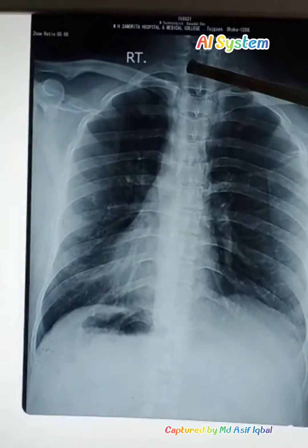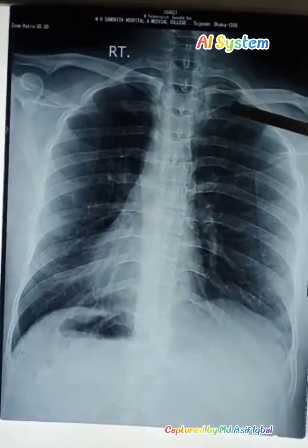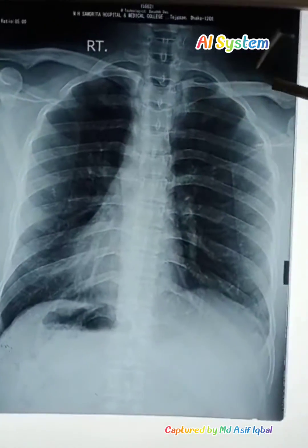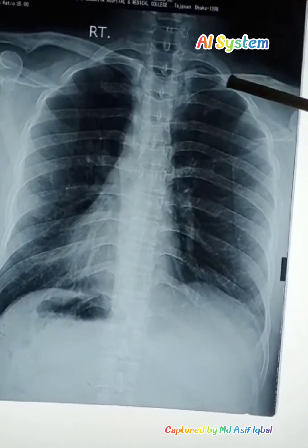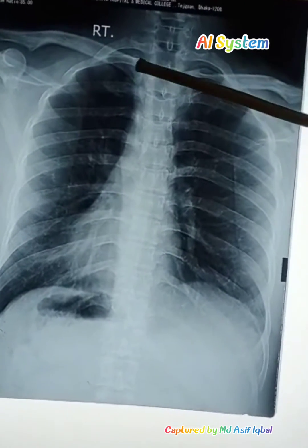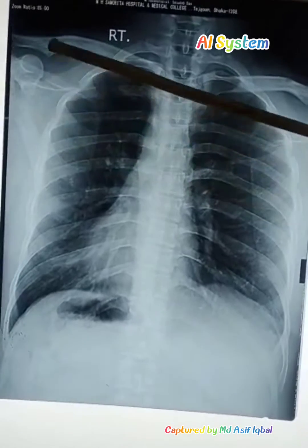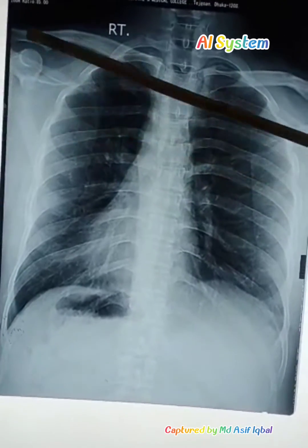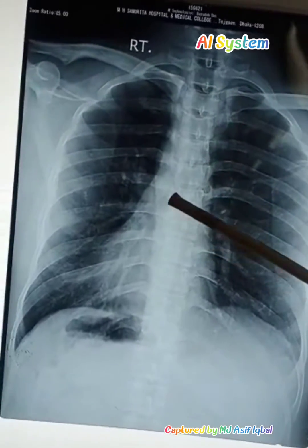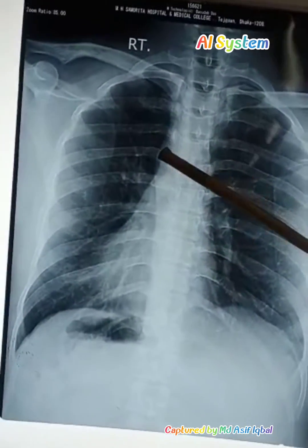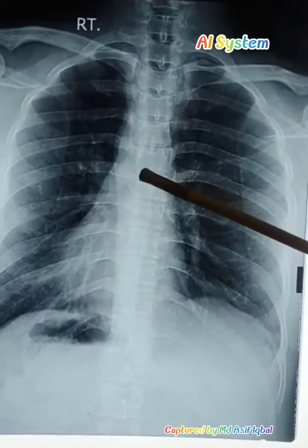This is the shadow of the clavicle, and this is the shoulder joint. Now, this is the shadow of the heart.